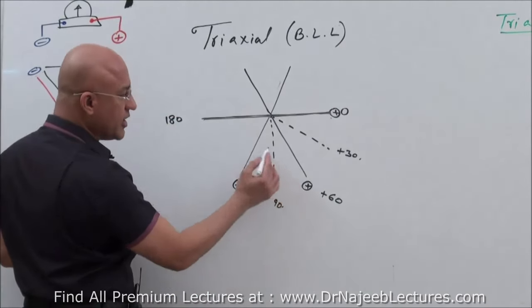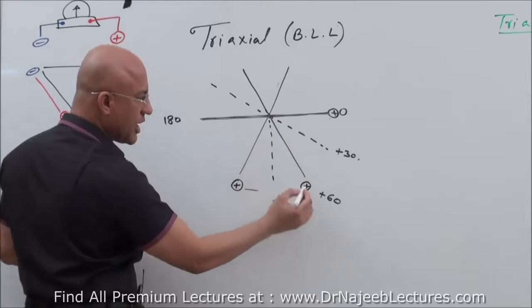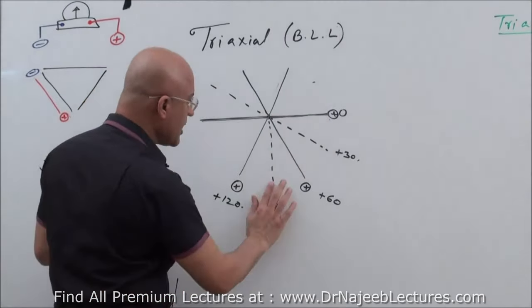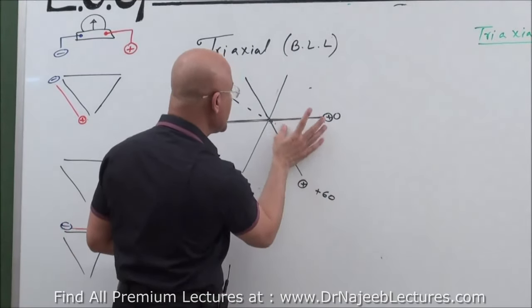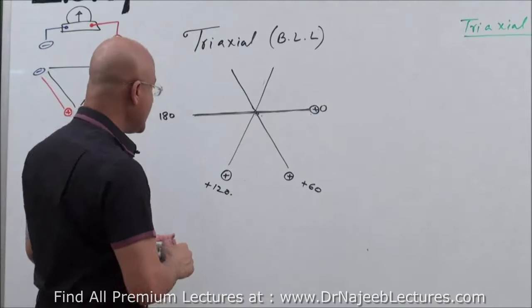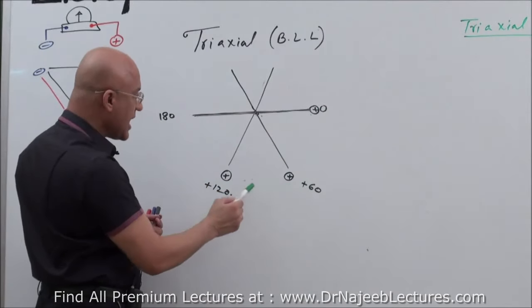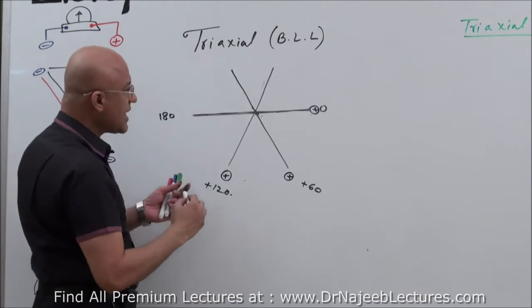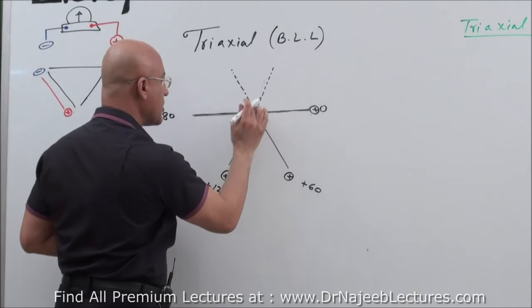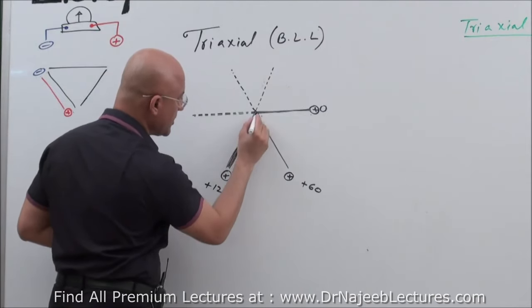And this is plus 90, but none of the bipolar leads is along this. This is plus 60, and this is plus 120, and there is no lead along this. So we can say that bipolar limb leads have a spatial orientation in the frontal plane. Lead number 1 is oriented at 0 degrees, lead number 2 is at 60 degrees, and lead number 3 at 120. I will make the positive ends thickened and the negative ends dotted.